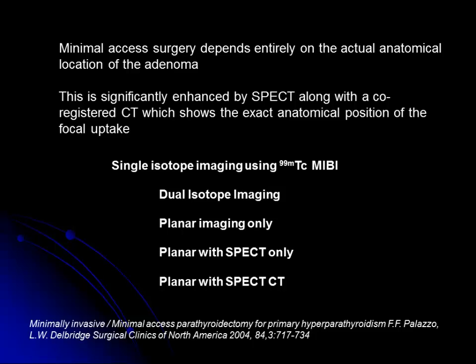It depends on the site where you are working, whether you have SPECT CT or you are used to doing only planar imaging and a 2-point time scan. It's good enough as long as you are confident in what you are looking at and reporting, and guiding the surgeons. But with planar it becomes very difficult, because they need the depth, they need to mark the site, and they need exact dimensions. That can be shown only with SPECT CT.